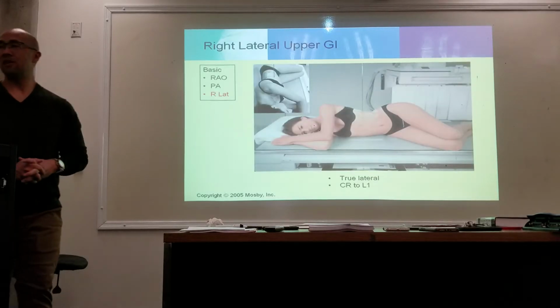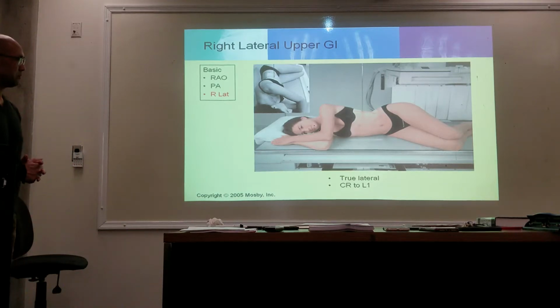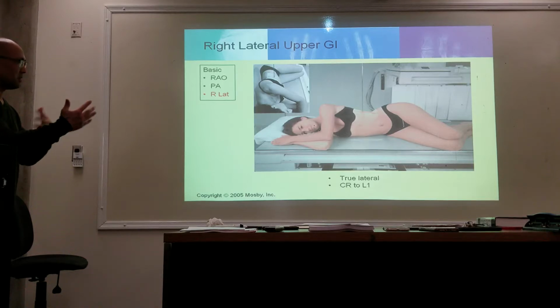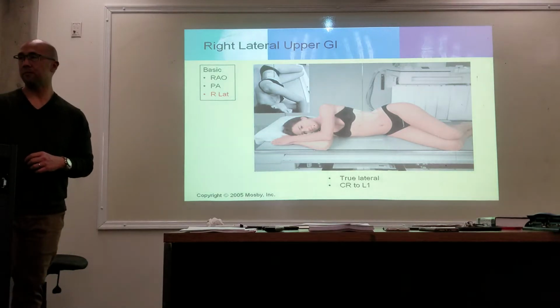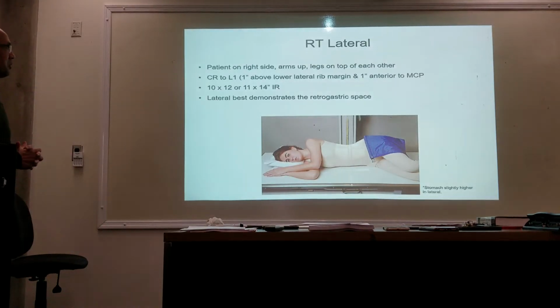And then we have the right lateral. Patient is in the right lateral. True lateral. So again, it's all the same level. It's always at the level of L1. Okay? So the patient's on the right side, arms bent, legs bent, center at the level of L1.